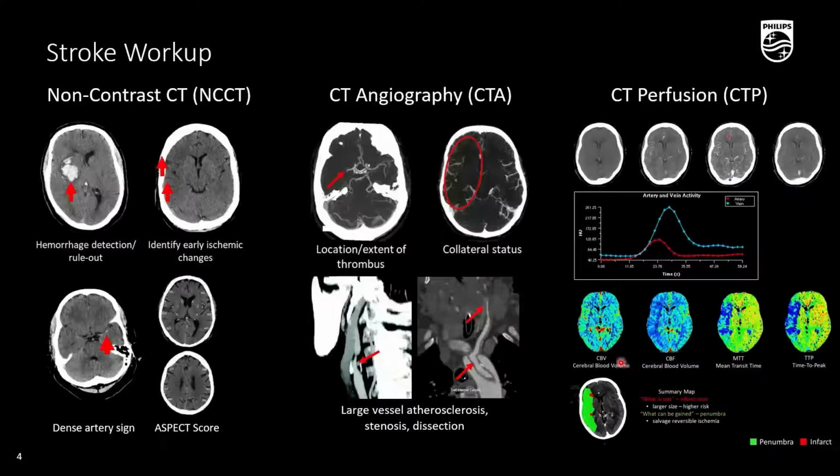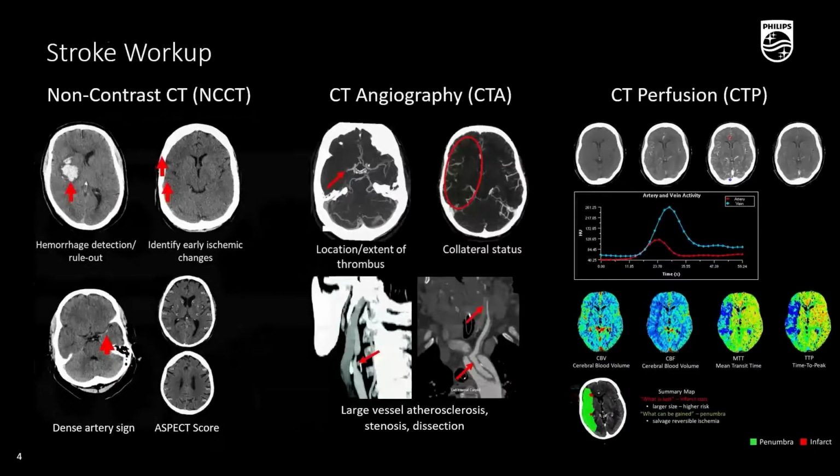And so these are all very important for defining the treatment and knowing what the possibilities are to save as much tissue as possible.